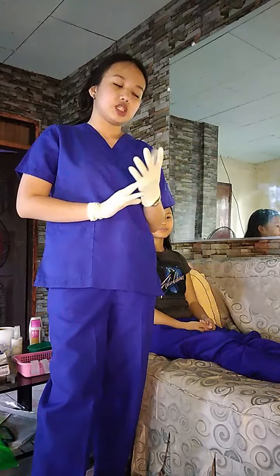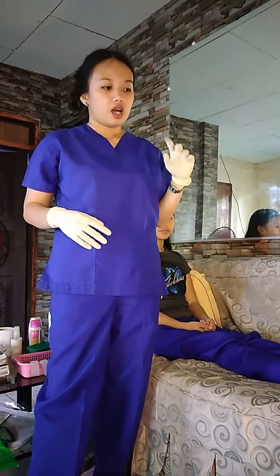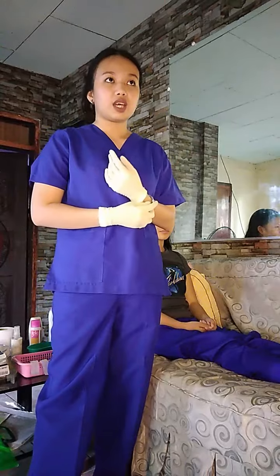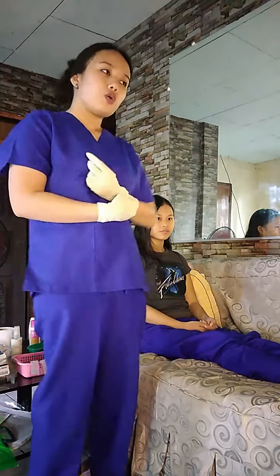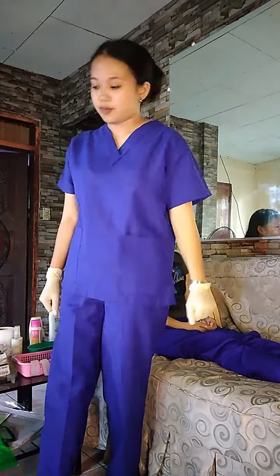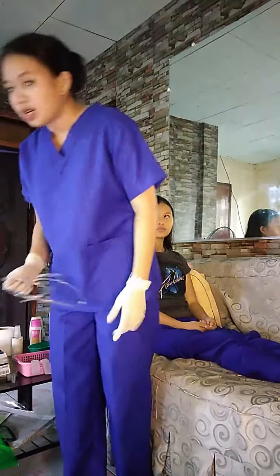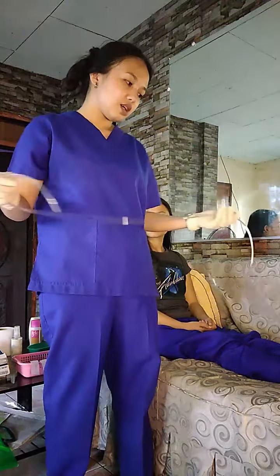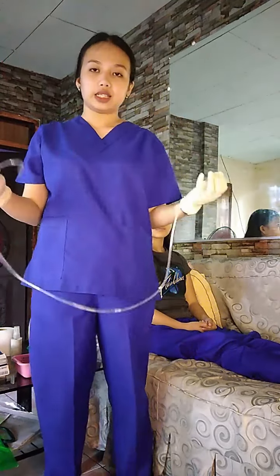So it is important to position the patients this way para hindi makapasok yung tubing into the trachea which will cause suffocation to the patient. And it can also cause infection. So, pagka-position natin kay patient, i-identify ko na kung ano yung gagamitin kong tubing. So, ang gagamitin kong tubing is the size is F12 and then the color is white.